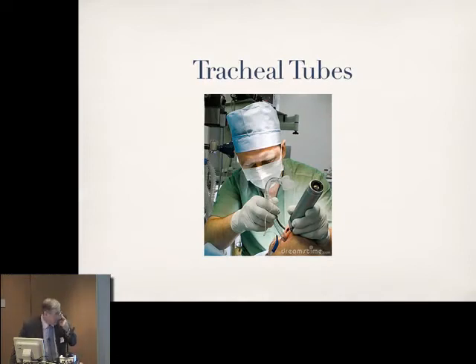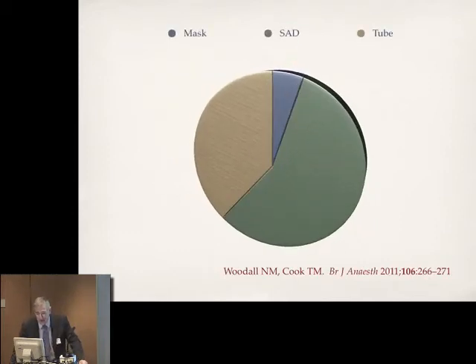I'm grateful to my colleague Mansukh Popat, who is co-author of the chapter on tracheal tubes, and what I'm saying reflects his views as well, and those of NAP4. You will remember that tracheal tubes were used, according to the snapshot survey, in 38% of anaesthetics during the period of the survey, but they account for some 52% of the cases reported to NAP4.